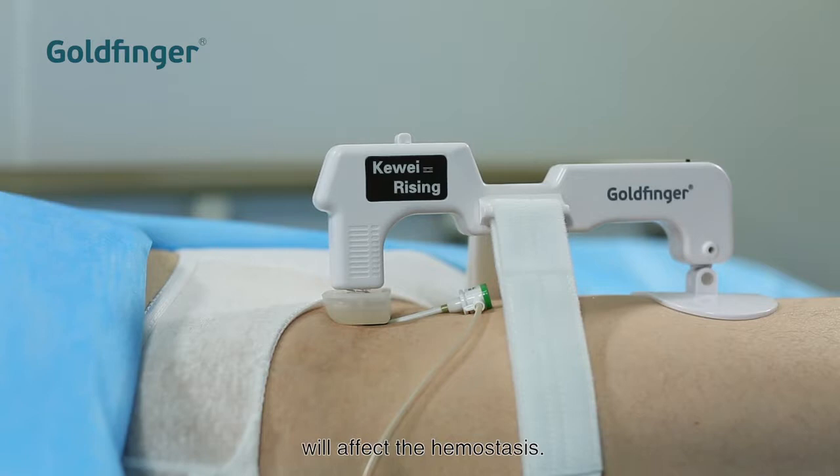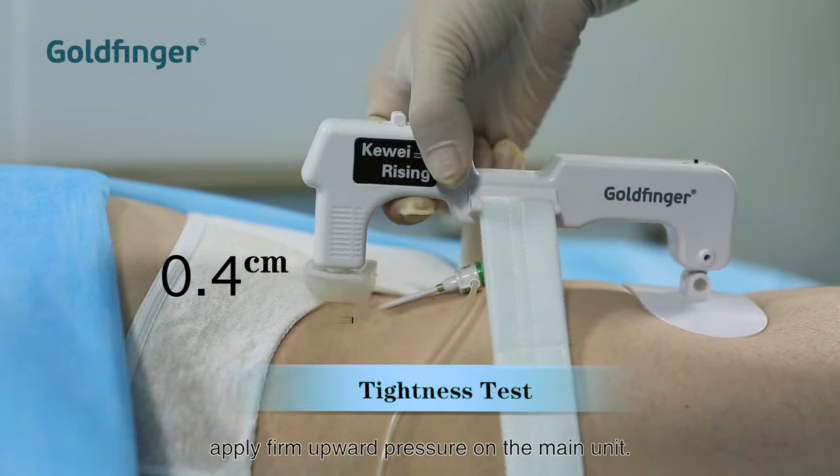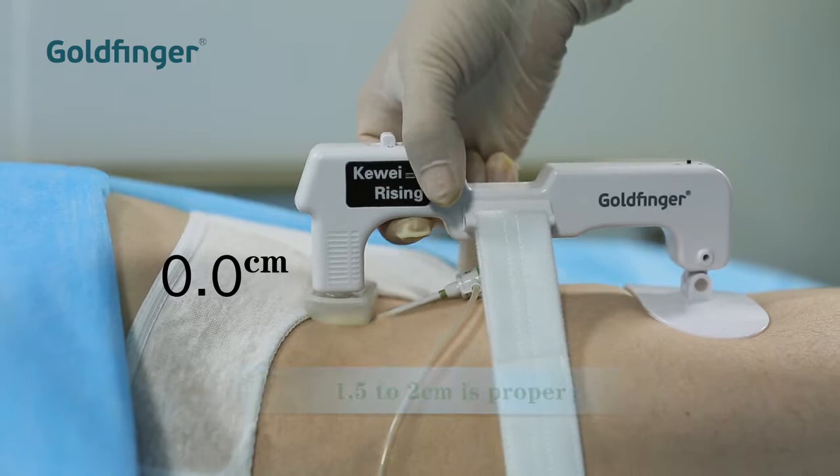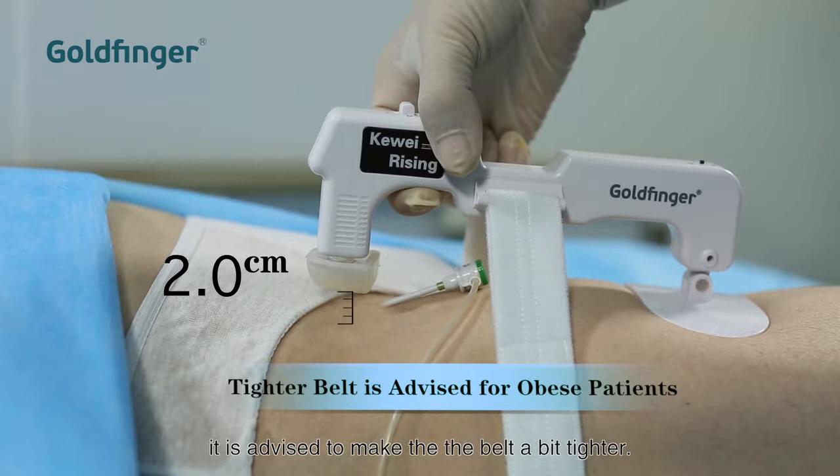The tightness of the belt will affect the hemostasis. With your index finger, apply firm upward pressure on the main unit. The dome should lift about 1.5 to 2 centimeters above the skin — that will indicate proper adjustment. For obese patients whose thighs are thick and soft, it is advised to make the belt a bit tighter.